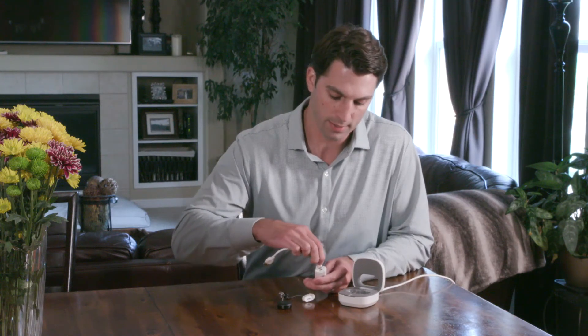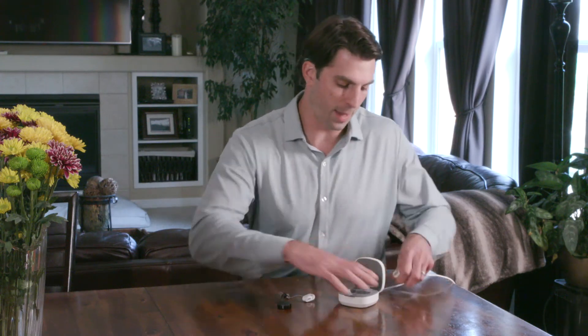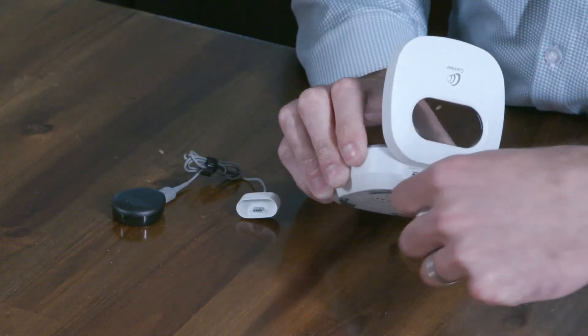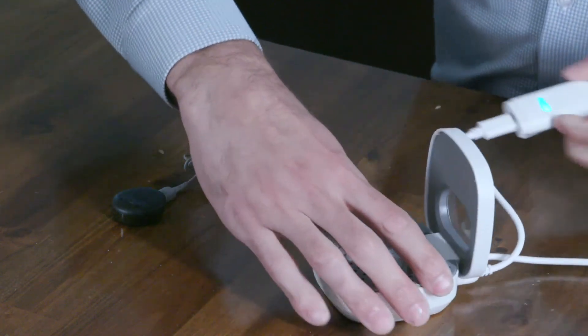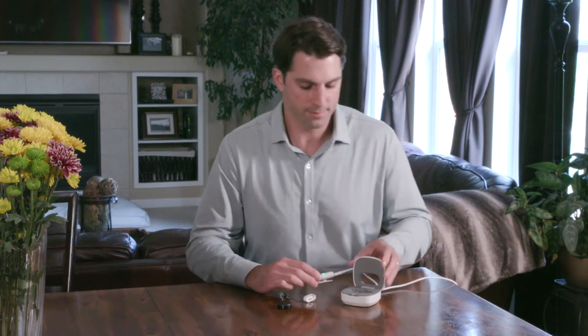To recharge the portable charger, take this cable here, plug it into the top of the portable charger, and plug the other end into the back of the home charger. It'll be ready for use in about three hours. It's that easy — now you know everything about the Kanzo 2 battery and charging needs.